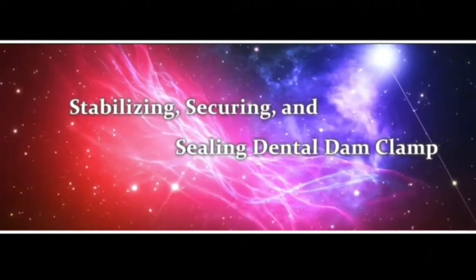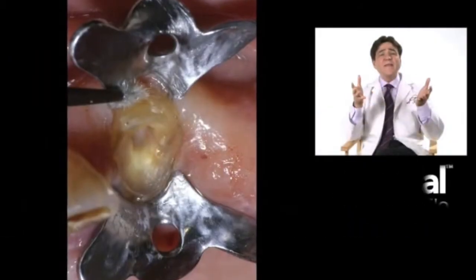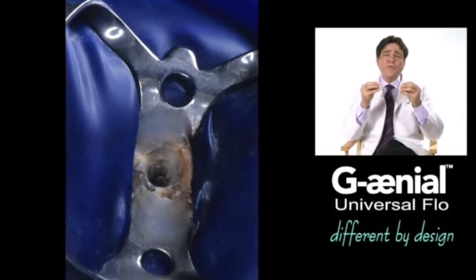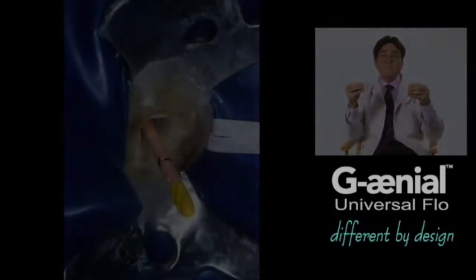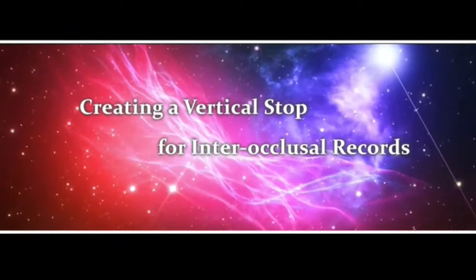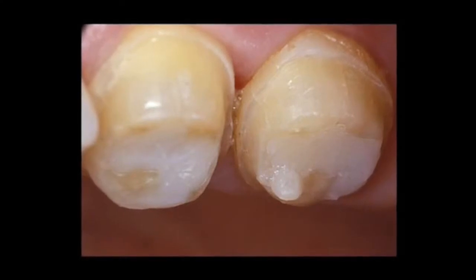Flowables can be used to stabilize, secure, and seal the dental dam clamp prior to procedure. Endodontic and adhesive procedures require proper isolation, and these flowable materials can be used to stabilize, secure, and seal the working field. Creating a vertical stop for interocclusal records. Flowable composite resin can be used as an accurate interocclusal record for the orientation of models for fixed prosthetic restoration.